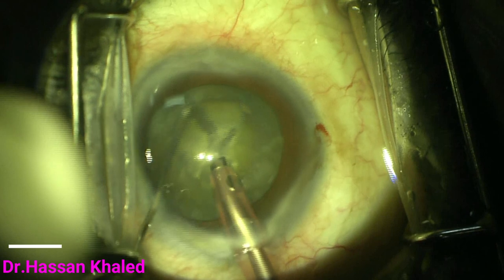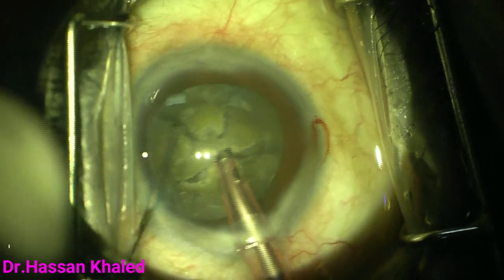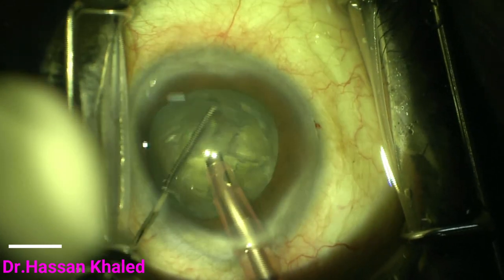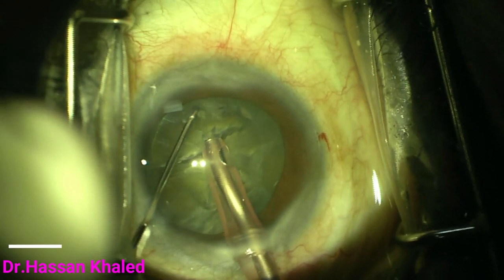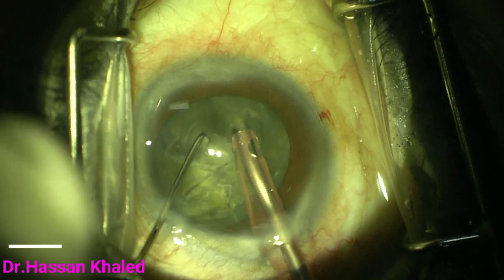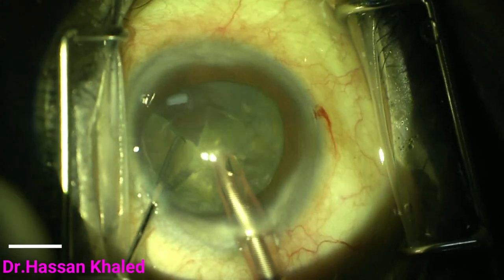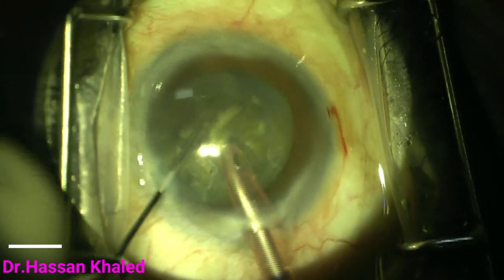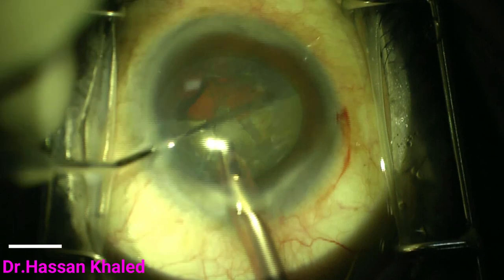This process is repeated over and over until the nucleus becomes progressively smaller, looking like pie-shaped pieces by the end of chopping. I then hold each piece and emulsify it. The place of emulsification is sub-capsular at the level of the iris, which is a safe place as it is away from the corneal endothelium and the posterior capsule.